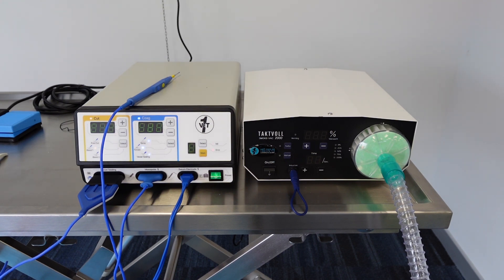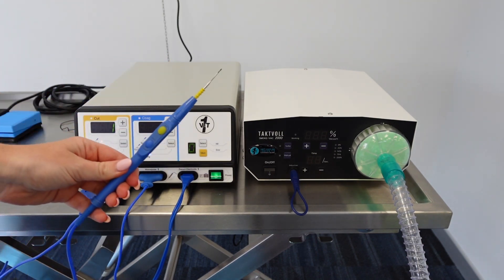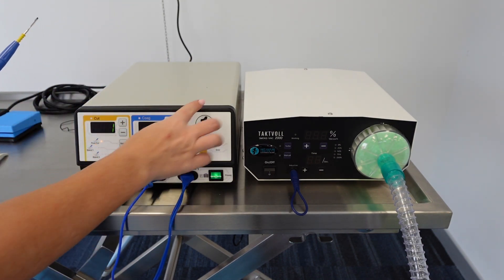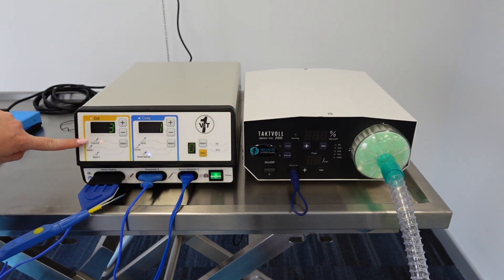Here is how they should look when they're all set up — with all attachments on, the linkage cable on the smoke evacuator, your filter, and your tubing ready to go. Let's go over a couple of the components of the electrosurgical unit regarding use and settings.